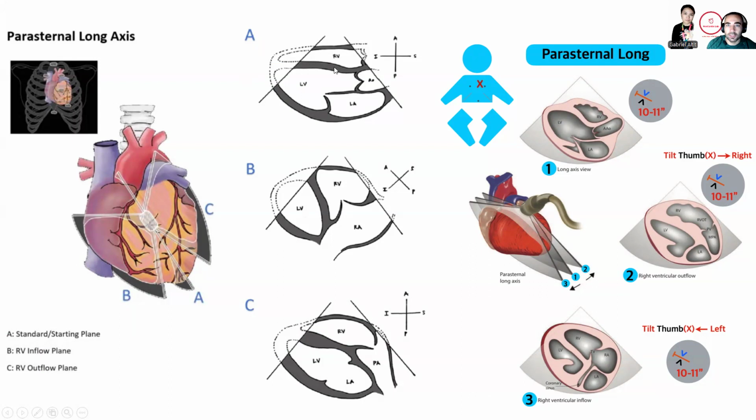Why long axis? Because we have the long axis of the left ventricle. You can see the mitral valve and the left atrium, and you can see that there's fibrous continuity with its usual outflow tract, which is the aorta. You can perceive a portion of the interventricular septum, which is obviously a complex 3D structure. Here we're only seeing one of the segments, and we see a bit of the right ventricle closer to its outflow tract.